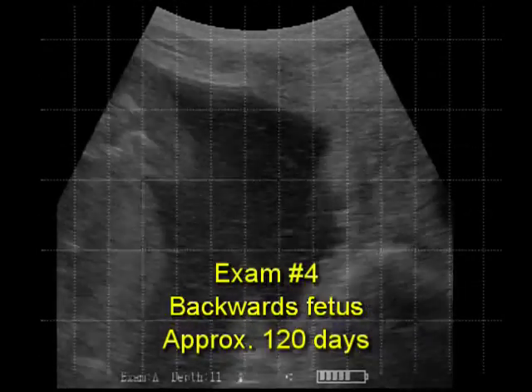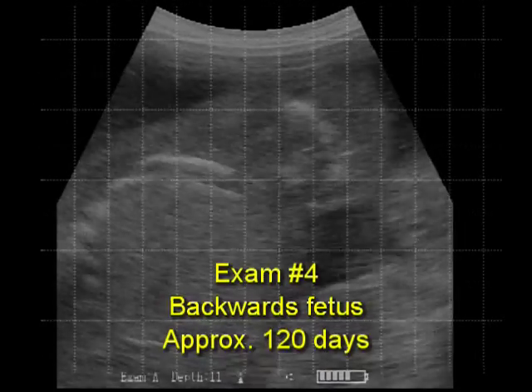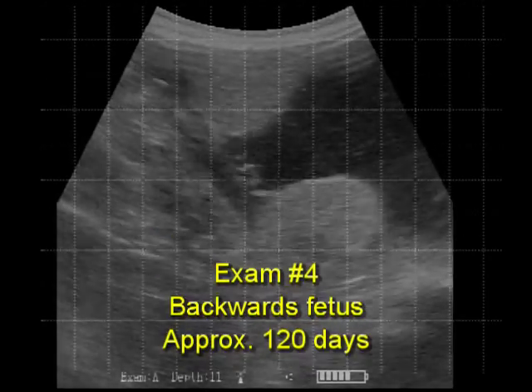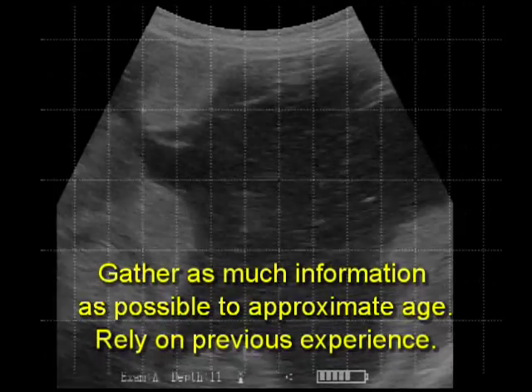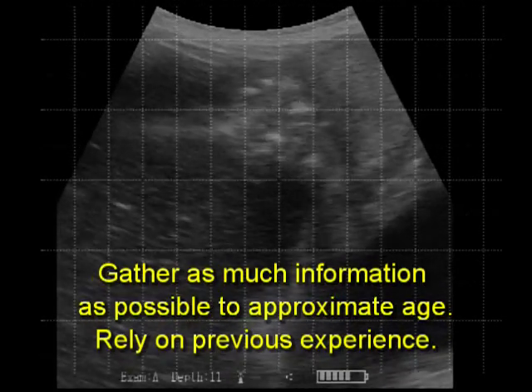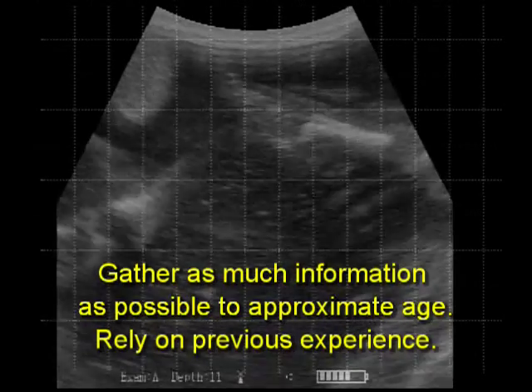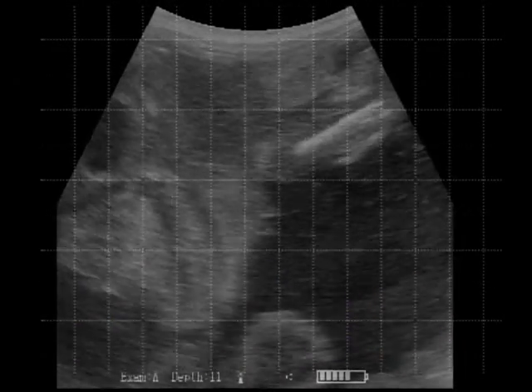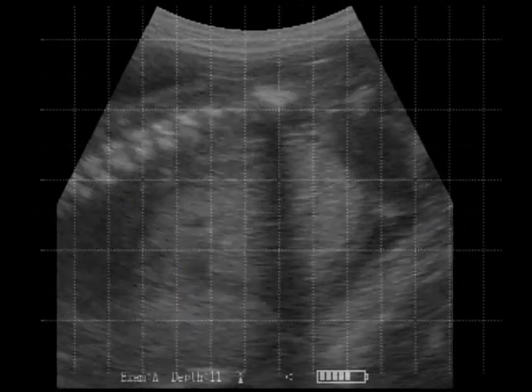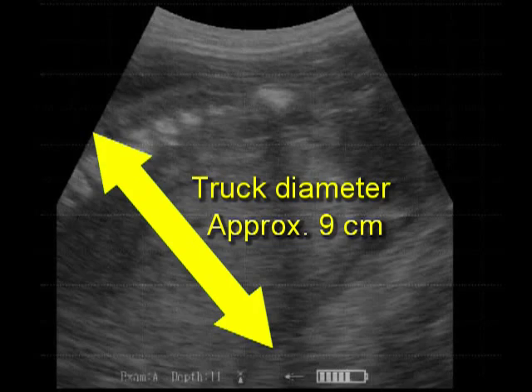Exam 4 is a backwards fetus that's approximately 120 days old. Sometimes it's tricky to get the probe down to the head with a backwards calf — gather as much information as possible to approximate the age and rely on previous experience. We'll work our way down to try to get a trunk diameter. Here we are at approximately 9 centimeters, about three quarters of the width of the screen.